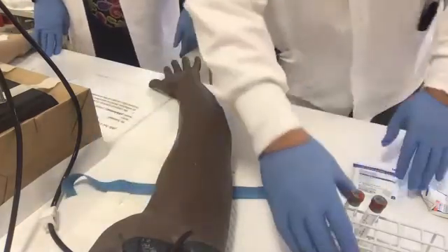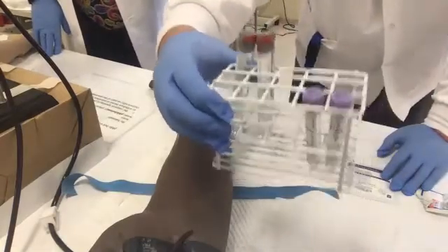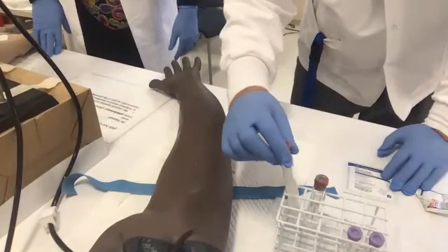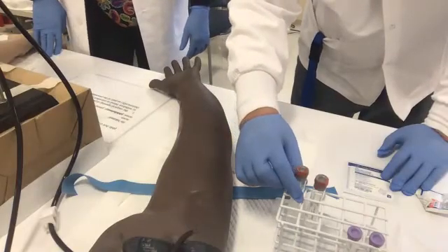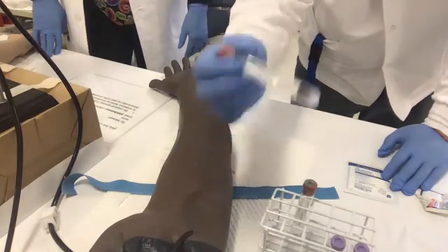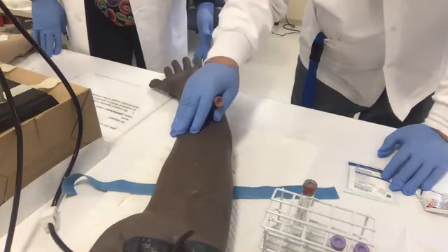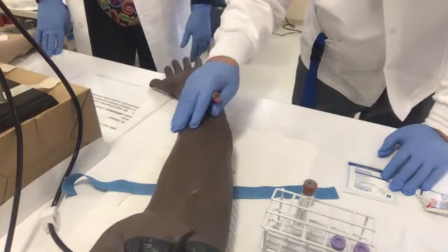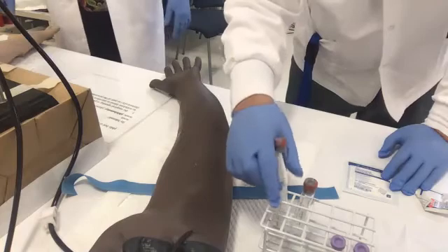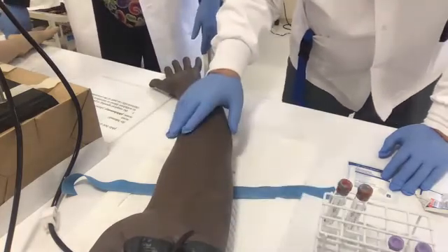I have my tourniquet. Now you'll notice that I have more than one tube, because of my adage that I mentioned a minute ago: 1 is none, 2 is 1. What happens if I'm only carrying 1 and it's bad? I have a needle here and I go, "Excuse me, Mr. Brown, I'll be right back." Honestly, I did that when I was an MA. It's embarrassing, and the patient's going to get pissed off.